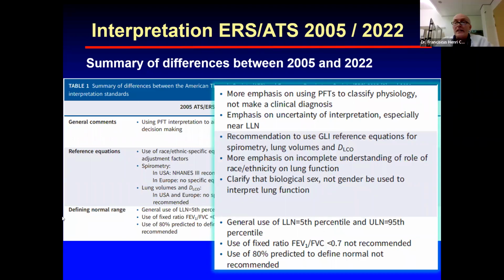Yeah, of course. In the diffusion test, we use carbon monoxide since it has to bind with the hemoglobin. And if there is no hemoglobin due to anemia, or the hemoglobin is already occupied by a heavy smoker, then of course you will make a mistake if you do not correct for this. So indeed it's more correct, but sometimes it's also more difficult to get this value. Yeah.